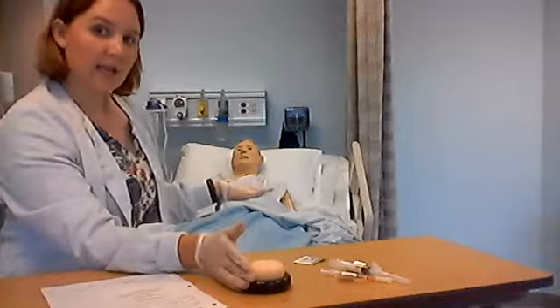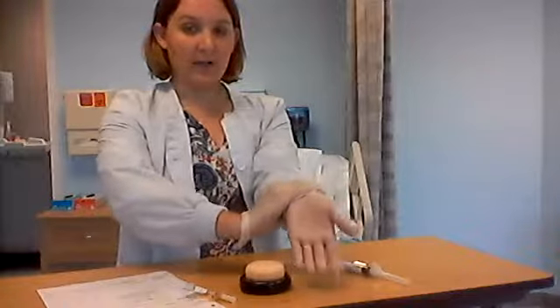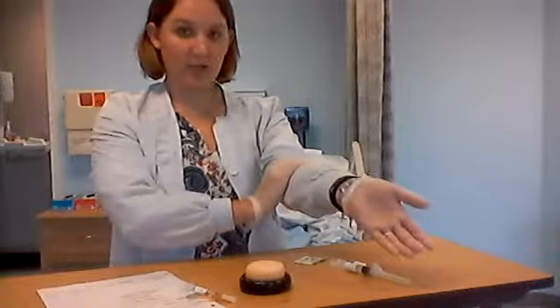I'm going to get my little prep pad. It's okay to move to the prep pad at this time, okay? On the patient, you've already identified all your sites. So now you just have to tell your instructor which site you're going to do, okay? So I'm going to start with my intradermal, my TB. The site is on my forearm, 3 to 4 fingers above the wrist, 3 to 4 below the antecubital space.